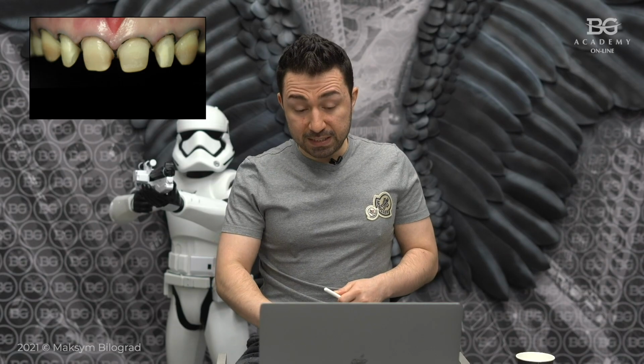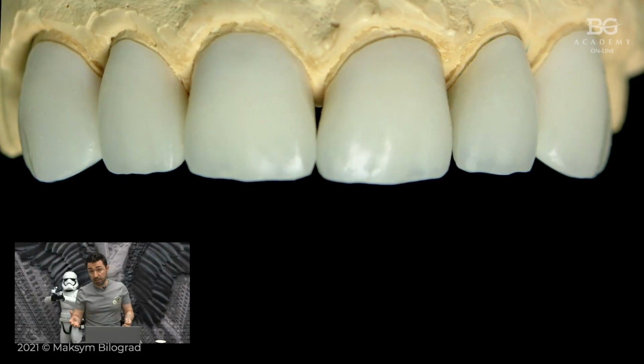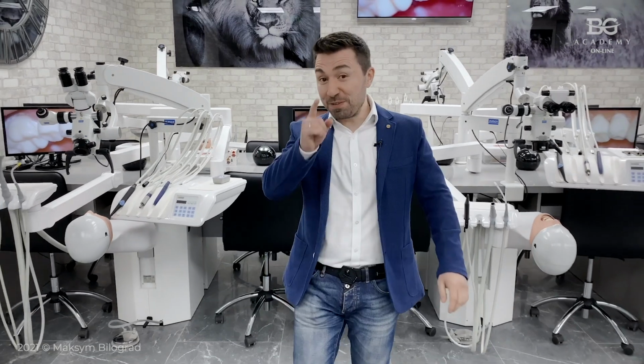And as I said, I sent composite material to my dental technician. I had a very opaque dentine from Aesthetics, the material from Dentsply.